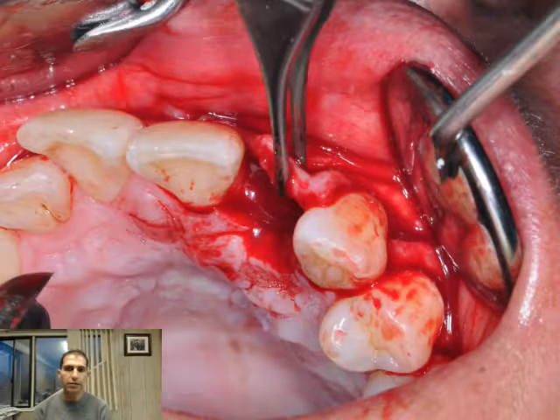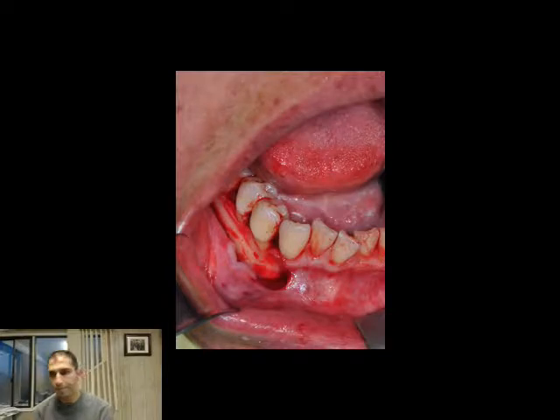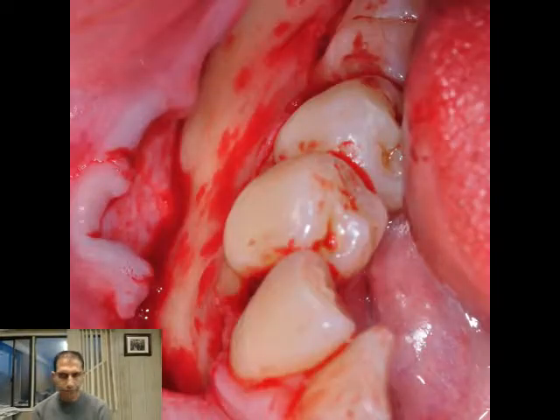This is a full thickness flap and here we're going to score the periosteum, releasing the flap to position it coronally. We want a tension-free closure. This is the harvesting side.